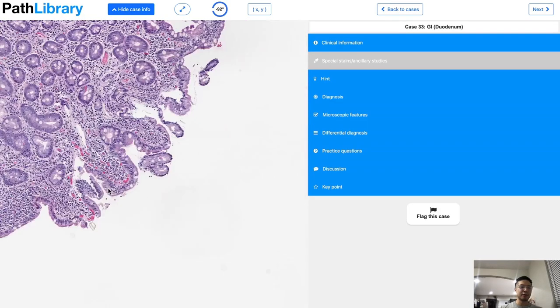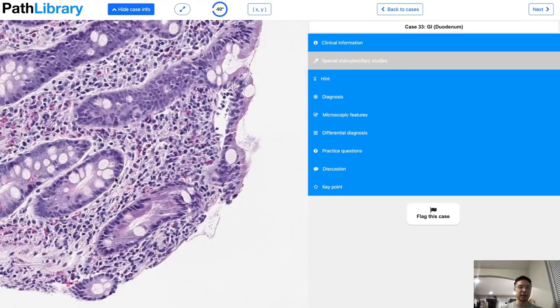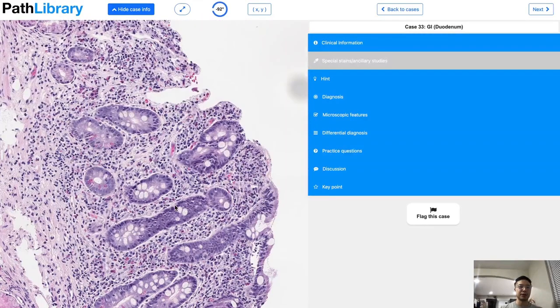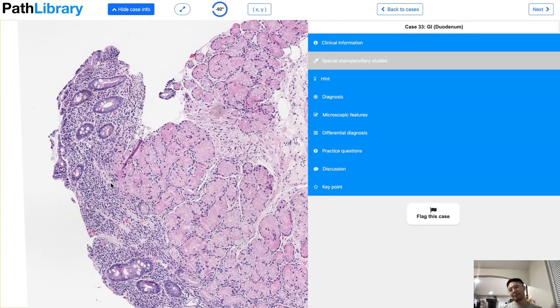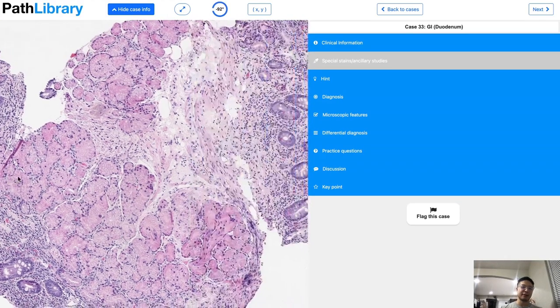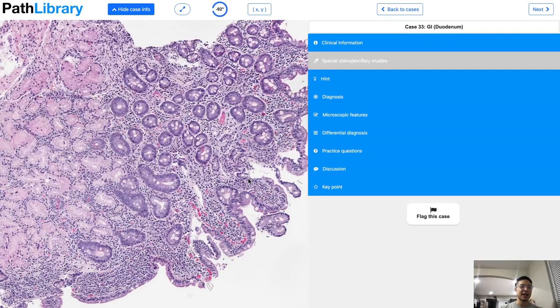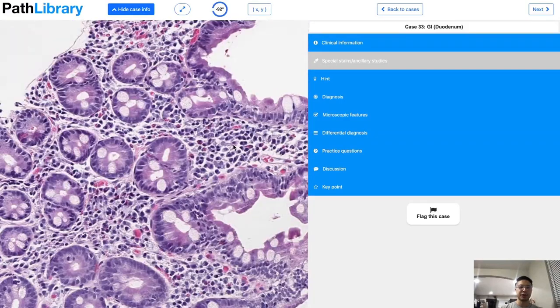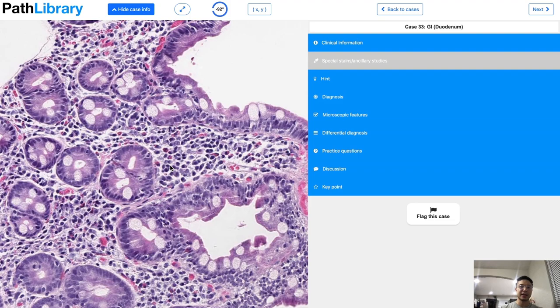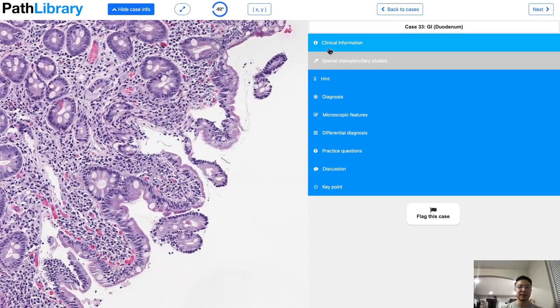Celiacs, I definitely want the information. I want to clinically correlate with it. I want that tissue transglutaminase IgA level. Or if that's negative, there can be a chance of false negatives if this patient is IgA deficient. Then in that case, you want to do IgG tissue transglutaminase levels. Also, some things that we should reflexively look for are plasma cells, so this patient doesn't have CVID, as well as Giardia. But I have a good hunch that this is celiacs.